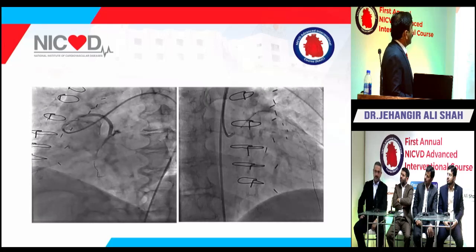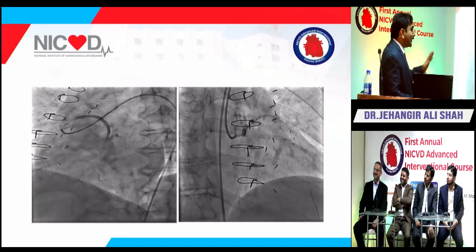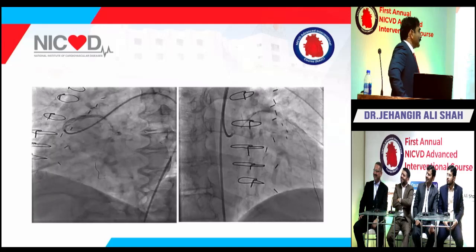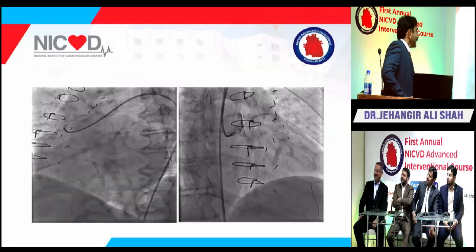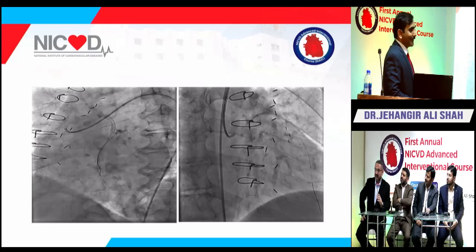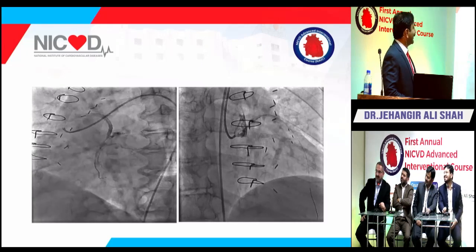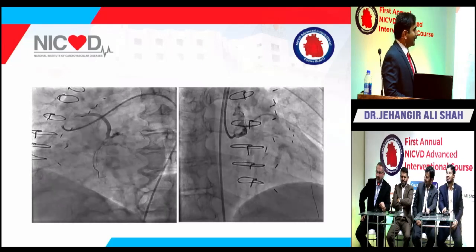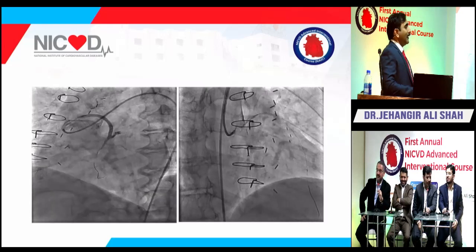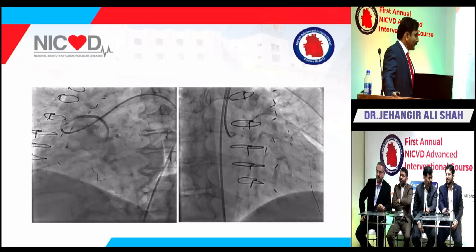So what will be the stent size? Atif is continuously insisting that you have to get a larger stent. So what do you suggest in this? I think in this case we can do two things. One is that we can go for IVUS imaging. I really don't know whether you went for IVUS in this case or not. Would IVUS help in this case? So you want to confirm the size? For sizing purposes, yes.